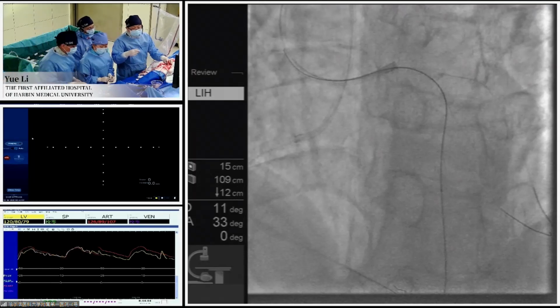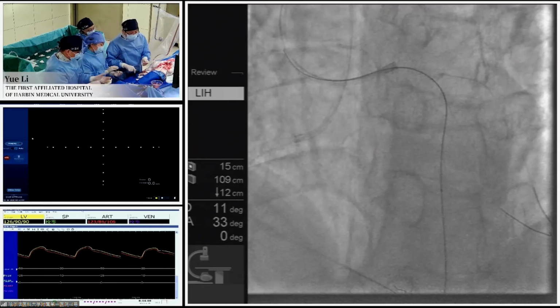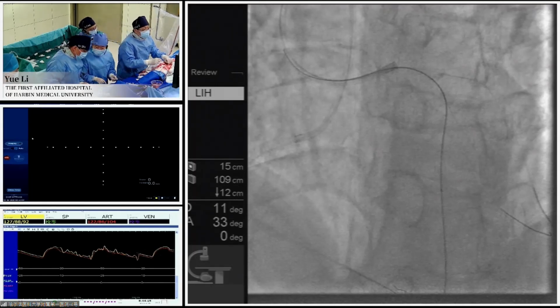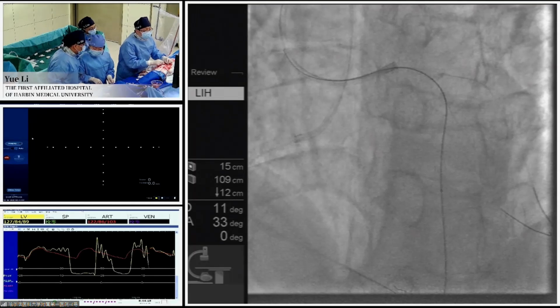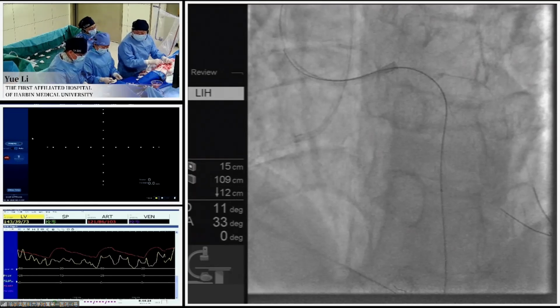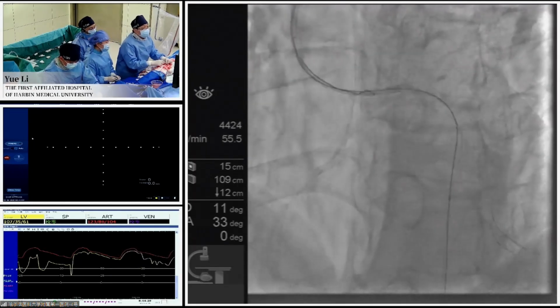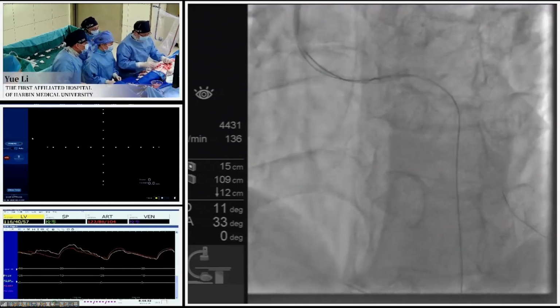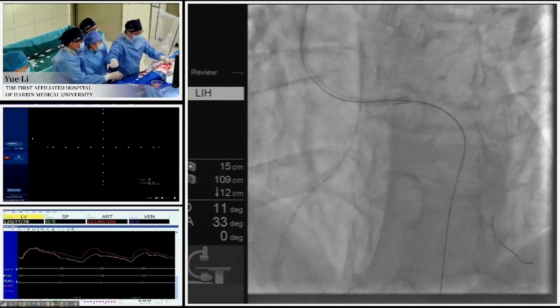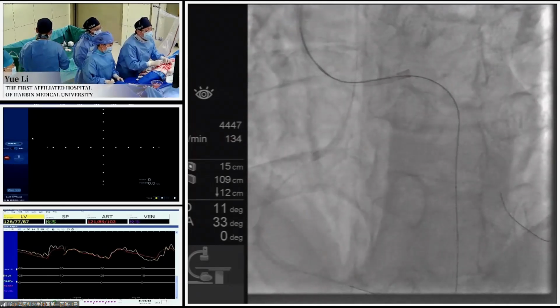So I already advanced the retrograde wire to the antegrade lumen. So commonly we could use balloon anchoring to advance the retrograde microcatheter and use a long wire like RG3, but externalization is very complex. So okay, I can install it there. We could try the rendezvous technique.